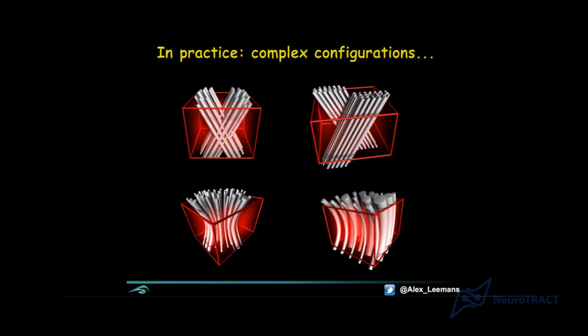And with the latter, I mean, literally, if you have a cube, a voxel, and they're all running in parallel, then sure, there's one orientation. And if you use the diffusion tensor model or the diffusion kurtosis imaging model, it's clear that there's one dominant orientation. But in this case, if I ask you, what is the orientation left top? Well, you see two crossings. You would say, there are two orientations. Clear. Two populations, they're crossing, two orientations. Same holds for the one on the right top.